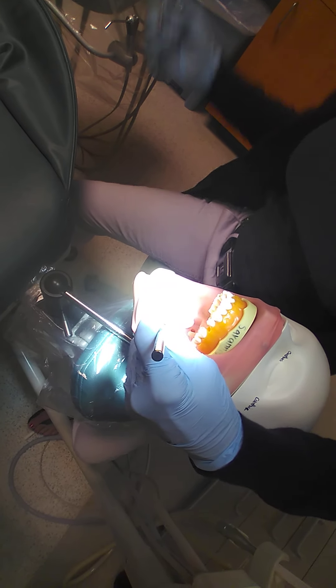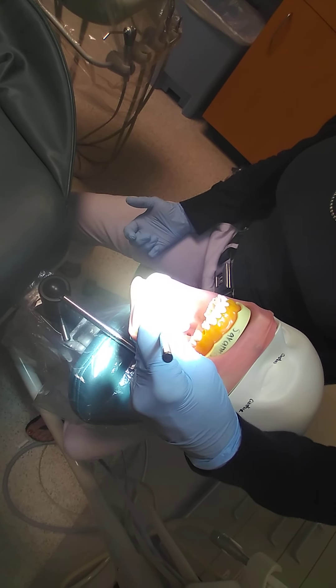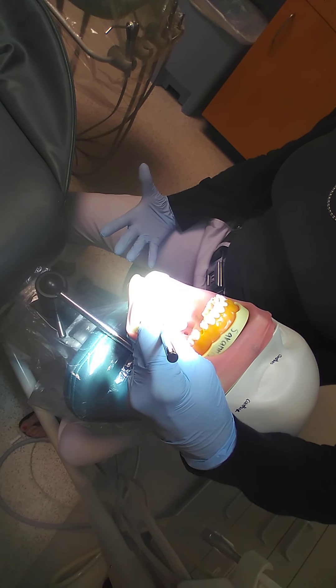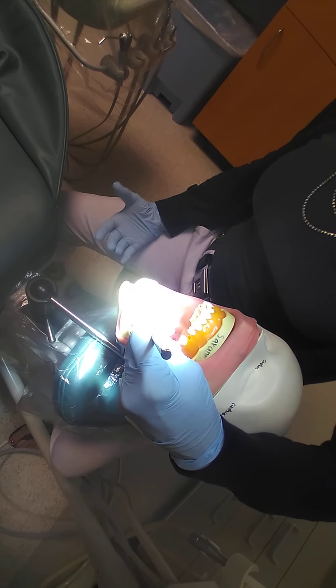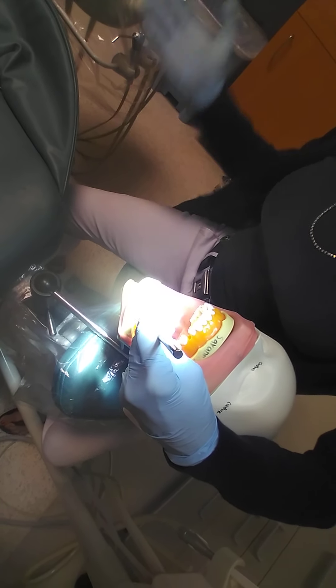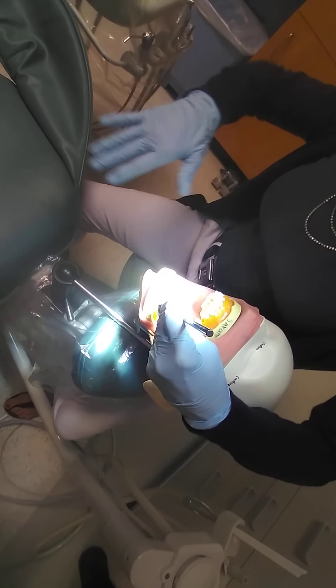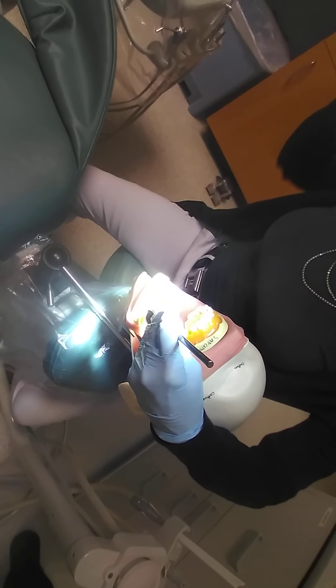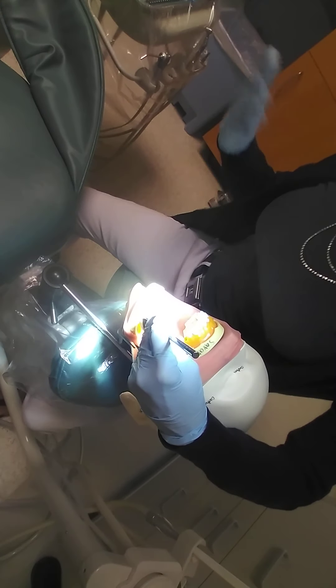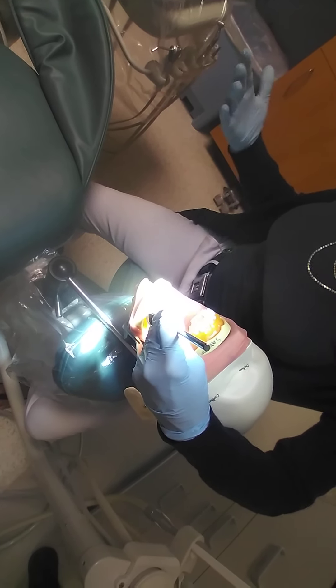Leaving the dentin glistening — we want the dentin to glisten because we don't want to have desiccated it, meaning we don't want to dry out the dentin tubules and collagen fibrils. Because if they're dry, they're going to lay down flat and block the dentin tubules, which won't allow the resin to penetrate. So we want to keep them fluffed so that they're slightly moist.